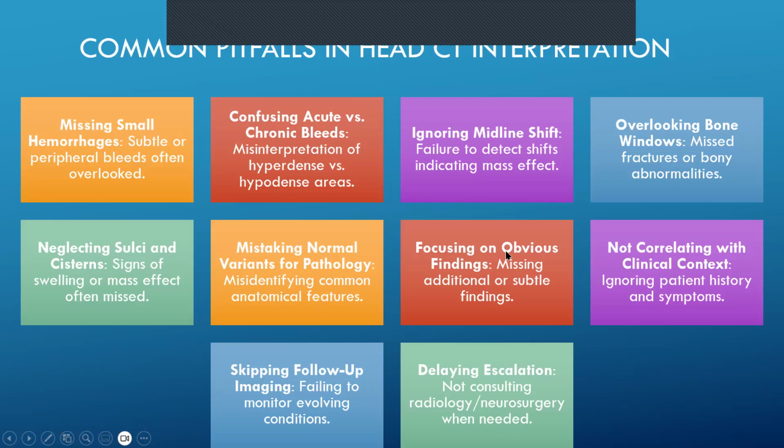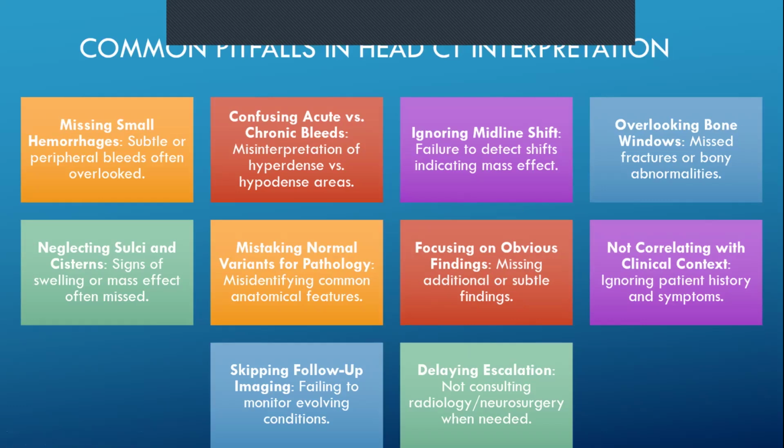Then one of the things that can happen in any part of medicine is focusing on obvious findings, and you miss other things. So you would, for example, maybe just look at the epidural and forget a fracture and miss another contusion or something like that. And then, of course, you must correlate it to the clinical context. So, is the patient a victim of trauma or not? Does the patient have high BPs? There's a lot of things that you need to look at. You can't just ignore the history of the patient.